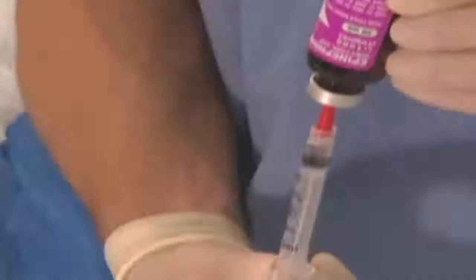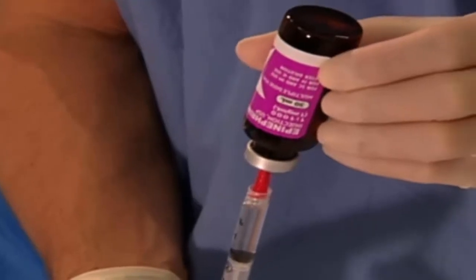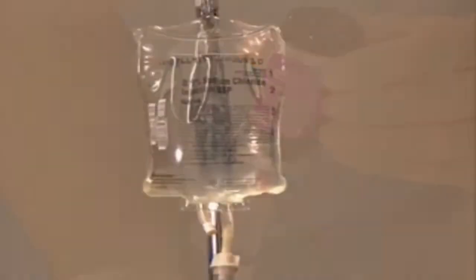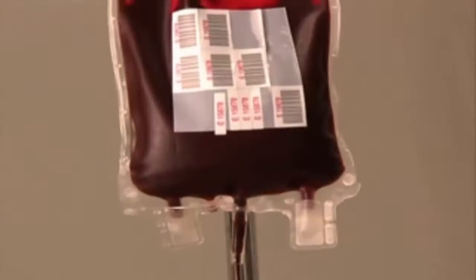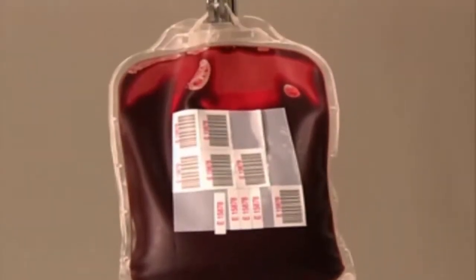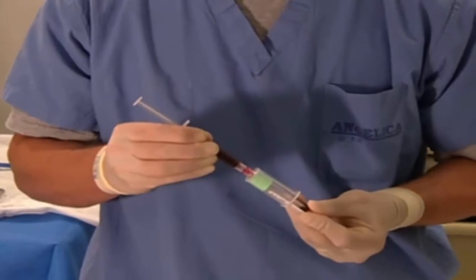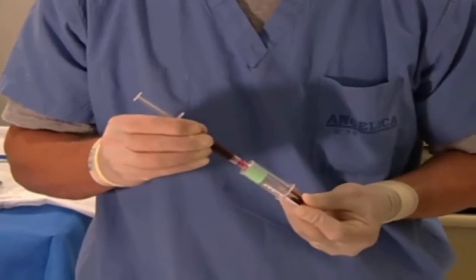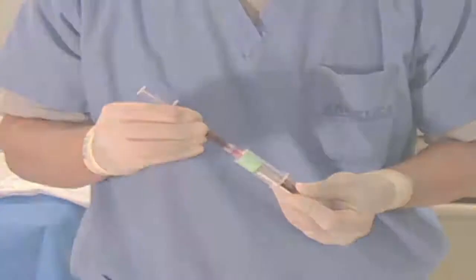Intraosseous access provides a rapid and reliable means for delivery of medications, crystalloid fluids, blood, and colloid products during pediatric resuscitation. In addition, when intraosseous access is achieved, blood samples can be obtained for laboratory analysis.